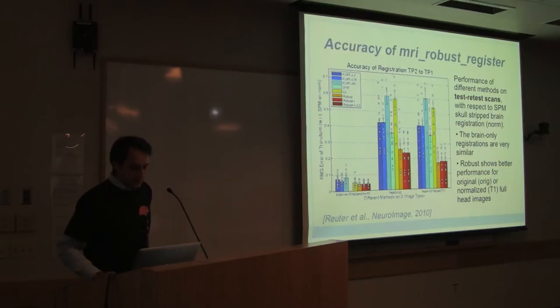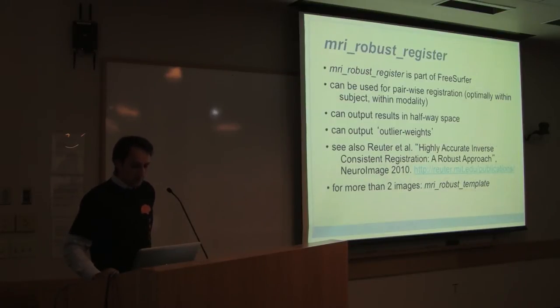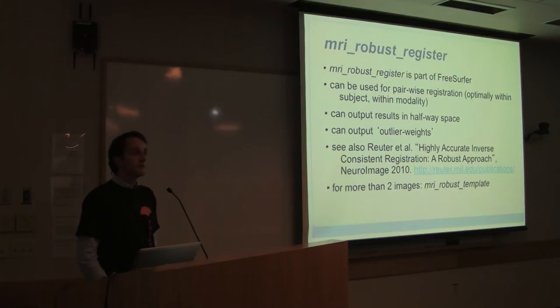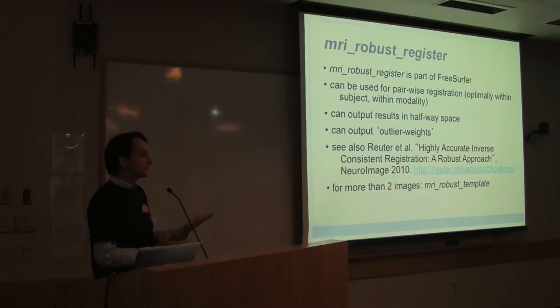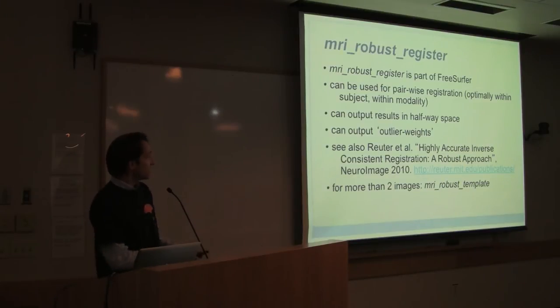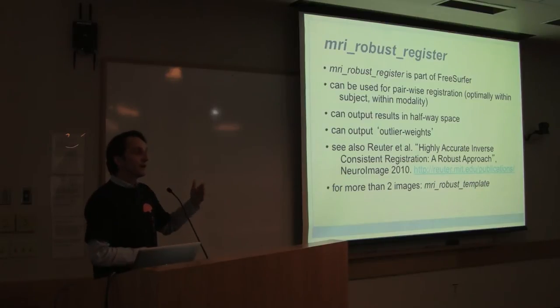This registration is part of the FreeSurfer package, called MRIrobustRegister, and you can use it independently without running the full longitudinal stream. If you have two images you want to register into a mid-space in an unbiased fashion, you can call this command. You can also compute outlier weights — the yellow overlay — to find changes between those images.